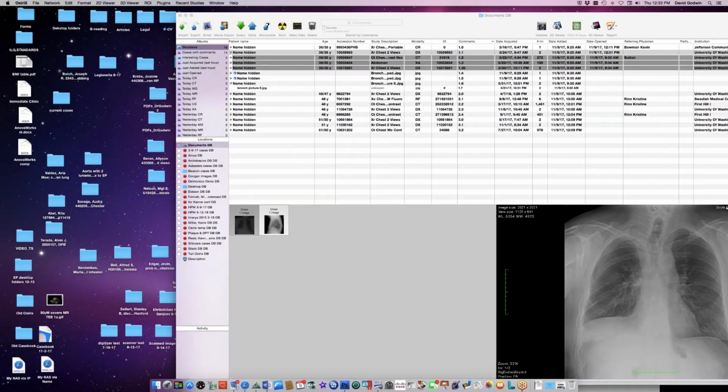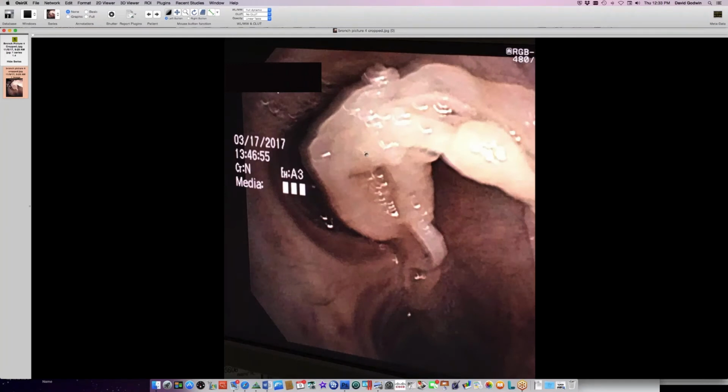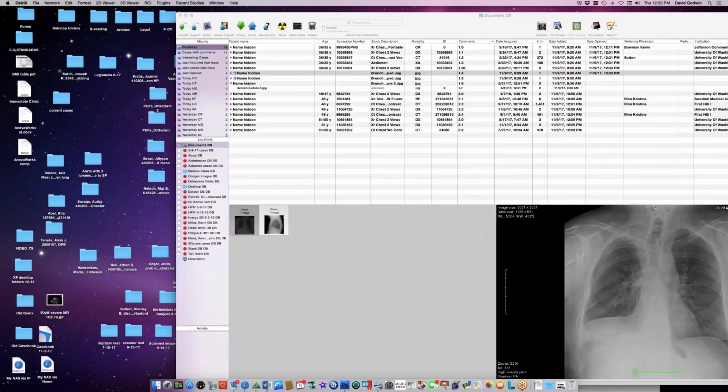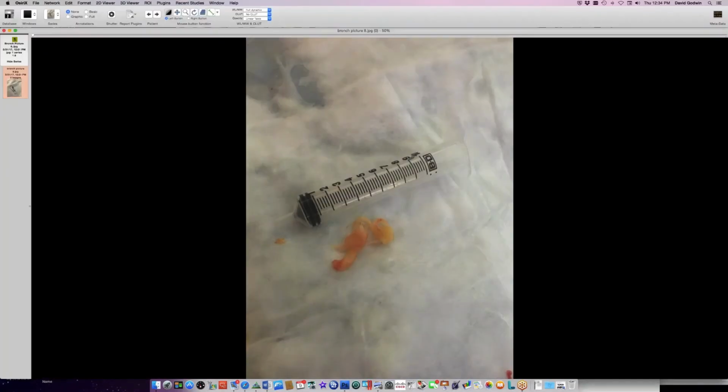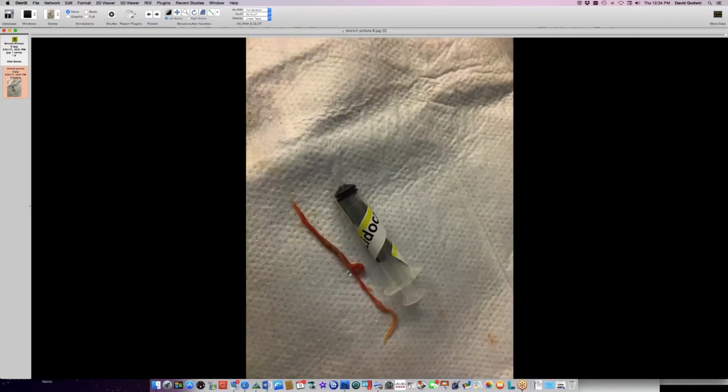So the bronchoscopic findings in this person were pretty dramatic. This is a huge slippery white mucus plug that was oozing out of her airway. Here is another view of this thing. She had the sensation of choking on these things. She didn't find this a pleasant experience. And here's one of these yellowish things removed here. Another view of these mucus plugs. She would just keep coughing these things out several per day. She was somewhat better after the lymph angiogram.